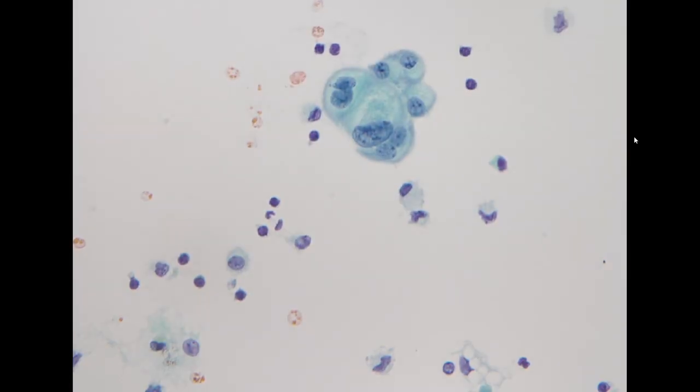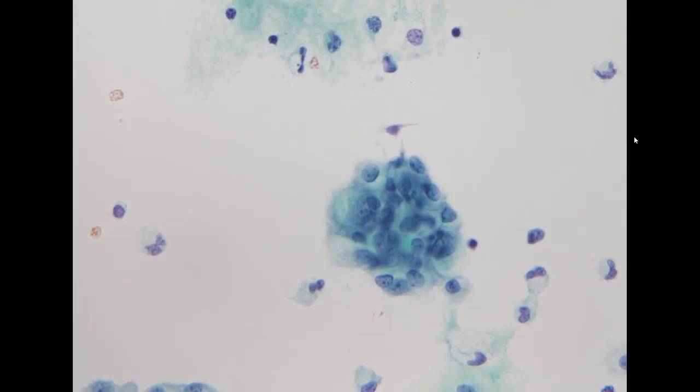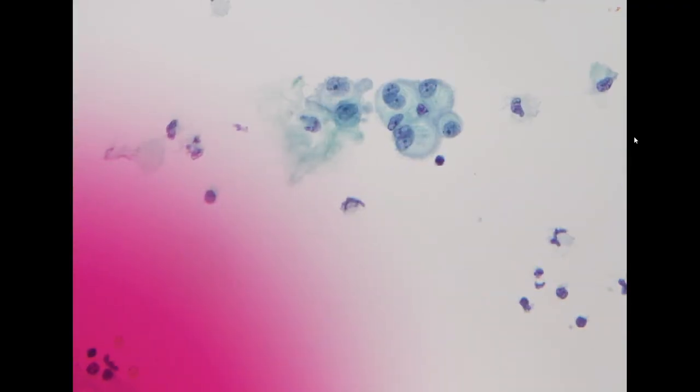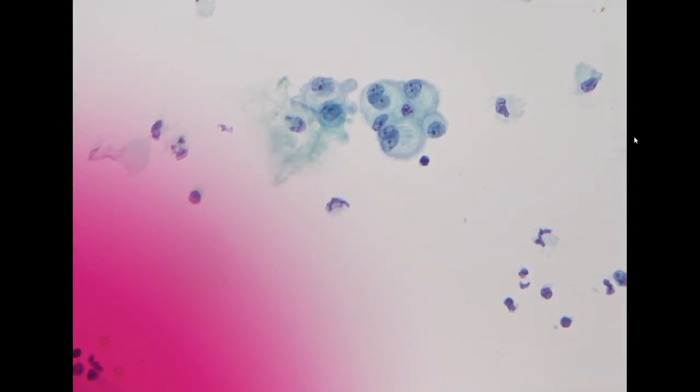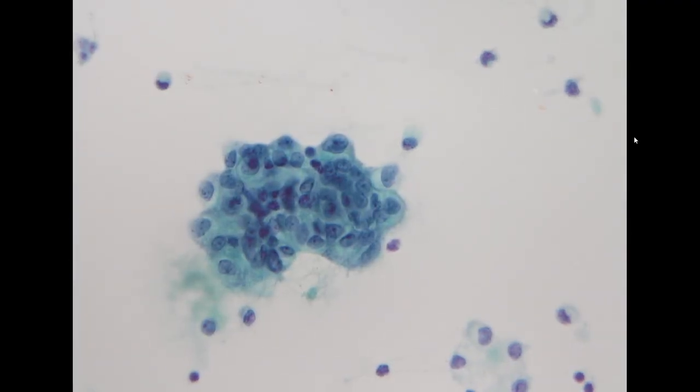So we would check. I personally think this is most likely reactive mesothelial cells, but in a cell ball pattern, which is relatively unusual. You will mostly see this in a mesothelioma. However, one exception is if the patient has liver cirrhosis.